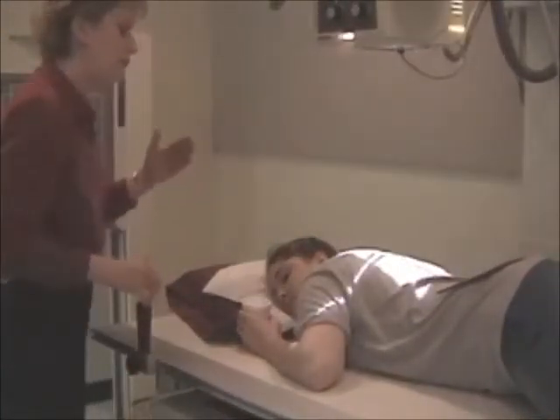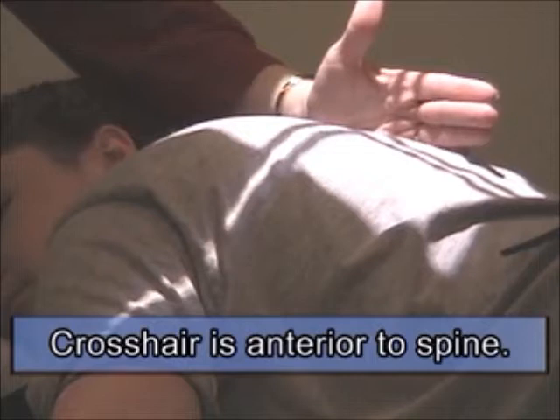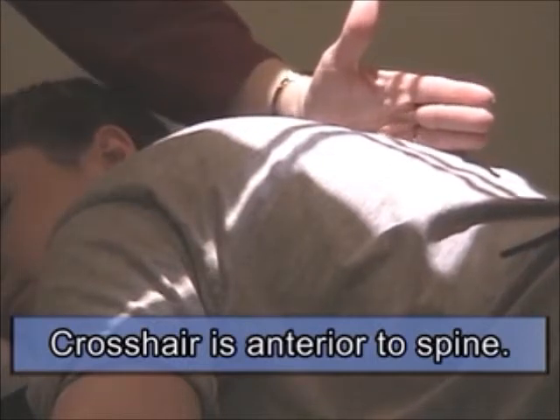Now I'm going to have you focus on our patient's back and look at this crosshair here. I'm going to try to demonstrate. Her spine is right here, the spinous process. And this crosshair is anterior to her spinous process, approximately 2 inches. It'll depend on the degree of obliquity that you position your patient in, but you've got to remember that the esophagus is always going to be anterior to the spine, no matter what position the patient is in.